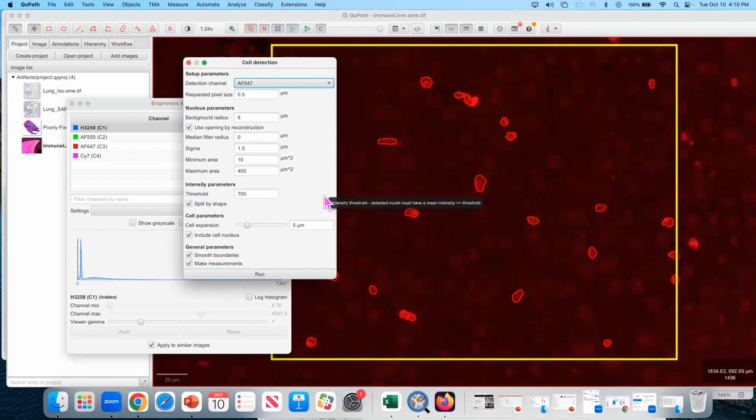Now, this image has a lot of artifacts, and you're not going to have an easy time doing something like this on an image that looks like that. It needs to be a much better quality image. If your cells are very bunched together, that's going to be a bigger problem, and that's a topic of tomorrow's discussion of Cellpose.